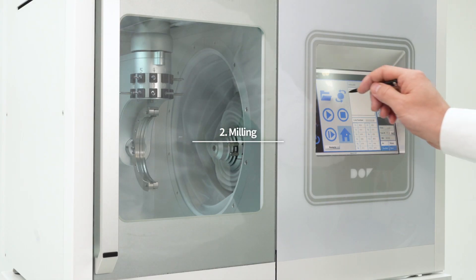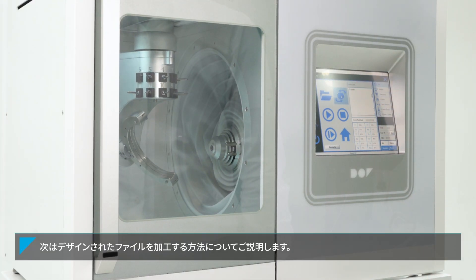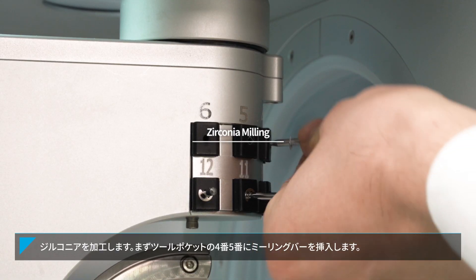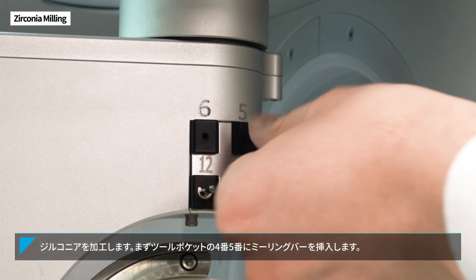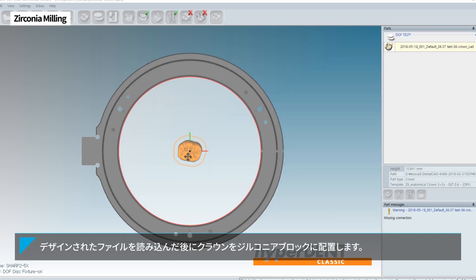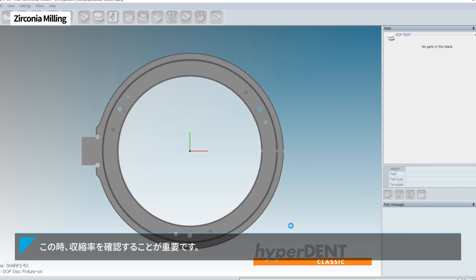Now let's find out how to mill with the designed file, starting with zirconia milling. First, insert the tools into tool ports number 4 and number 5. Then use the CAM program to import the designed file and place the crown in the zirconia block. At this time, it is important to check the shrinkage rate.